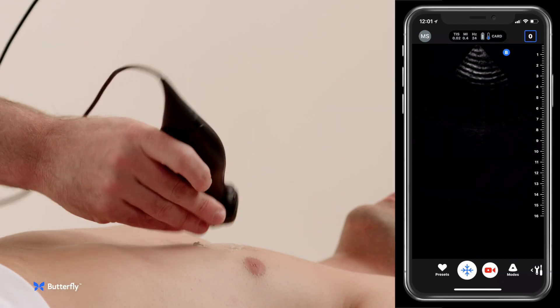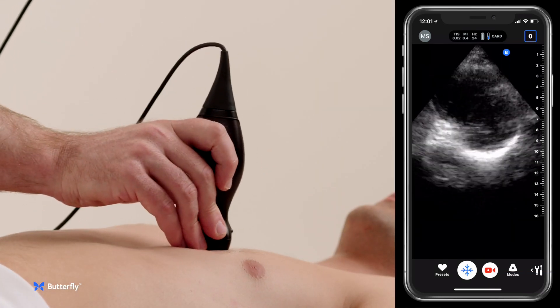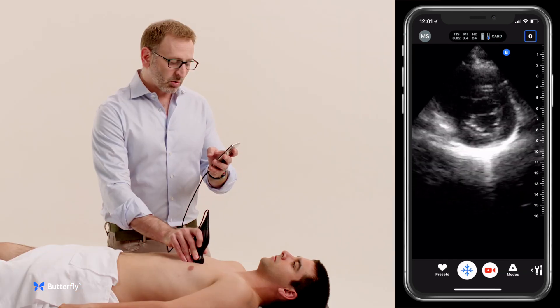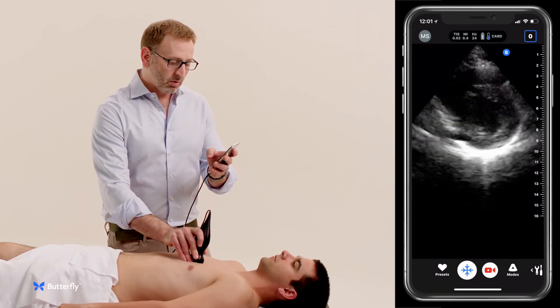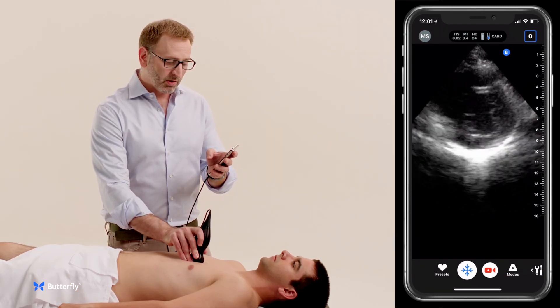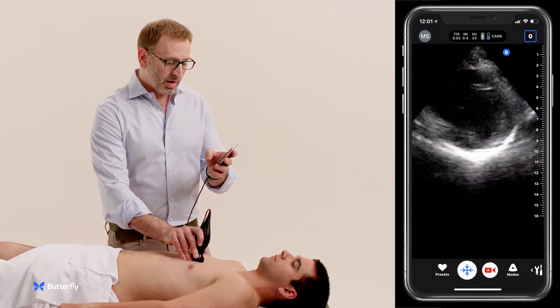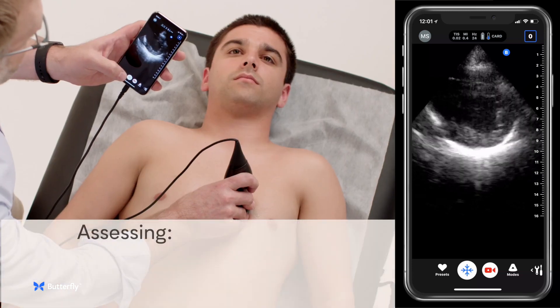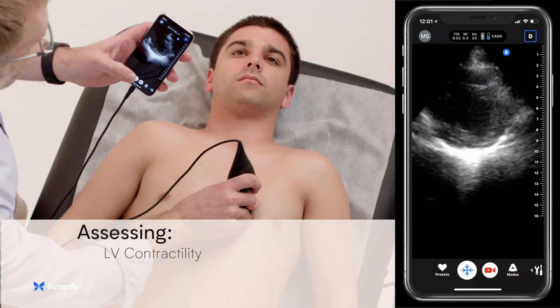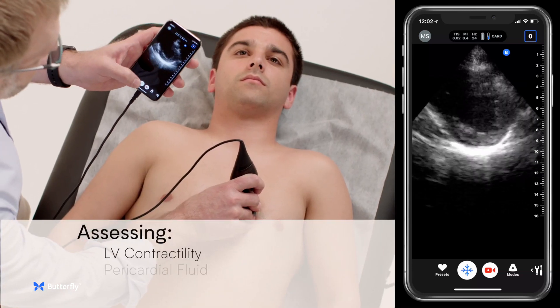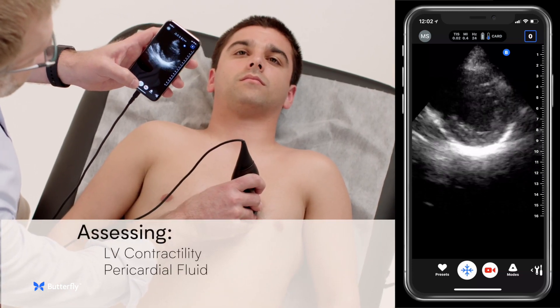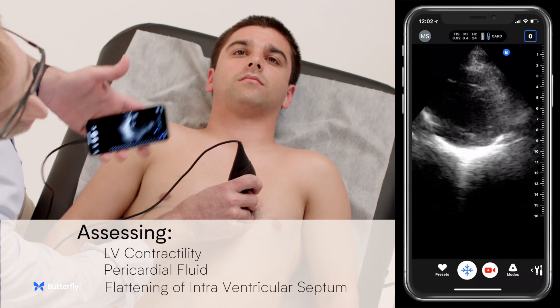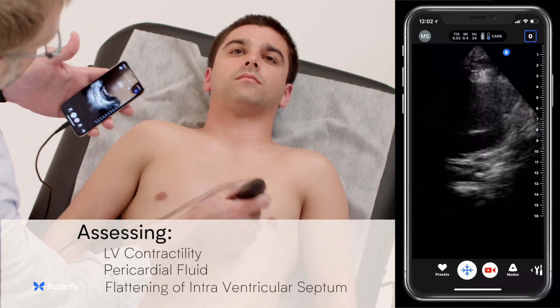We can then rotate the transducer to the patient's left shoulder to get a parasternal short axis view — in this case a mid-ventricular view at the level of the papillary muscles — looking for LV contractility, pericardial fluid, flattening of the interventricular septum, or signs of RV enlargement.